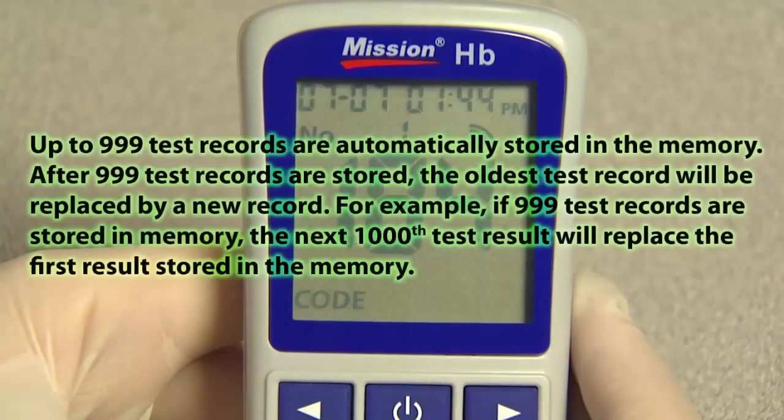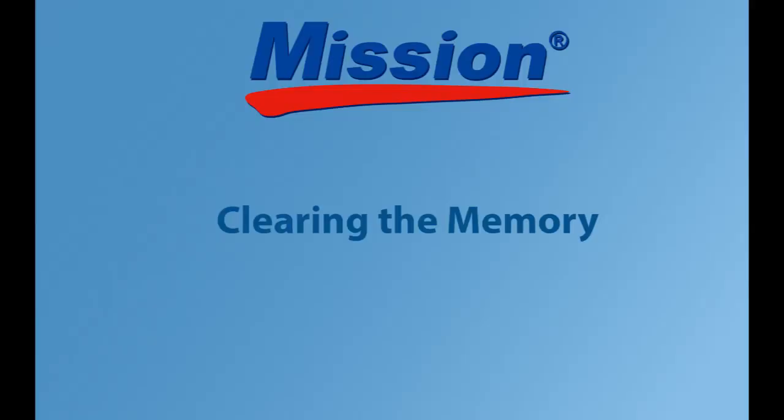Up to 999 test records are automatically stored in the memory. After 999 test records are stored, the oldest test record will be replaced by a new record. For example, if 999 records are stored in memory, the next 1,000th test result will replace the first result stored in the memory. Clearing the memory.